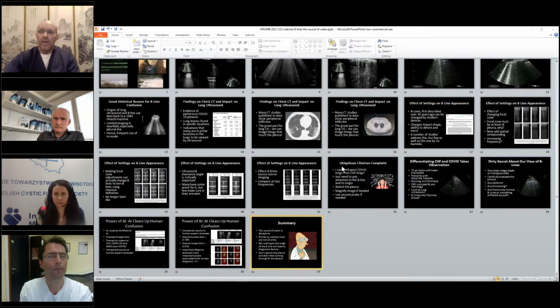Michael? So for me, it varies a bit, being in an emergency department, by the time pressure, how sick the patient is. A focused lung exam can be 1 to 2 minutes. Probably many are in the 5 to 10 minute range. And typically, I include a cardiac examination, including the inferior vena cava. So that's part of it. And usually I don't have more than 10 minutes to scan a patient, so it does have to be focal.